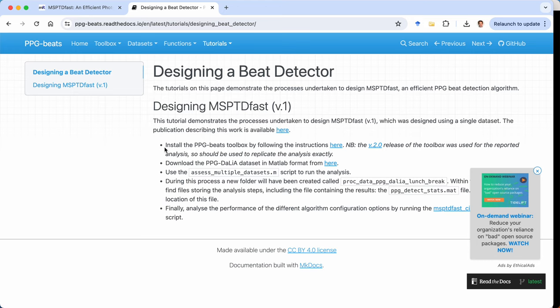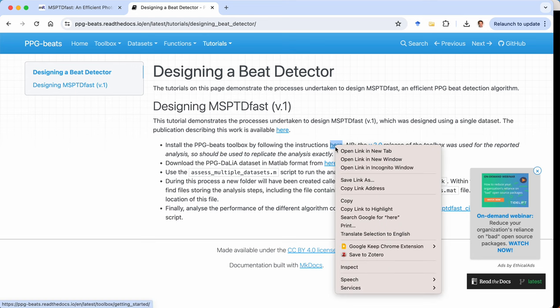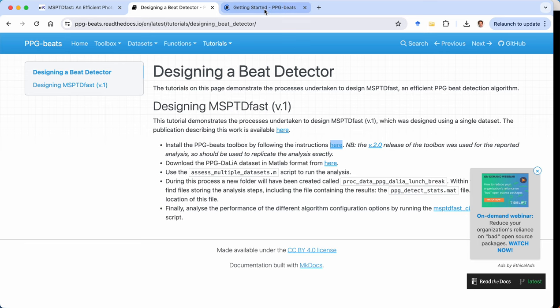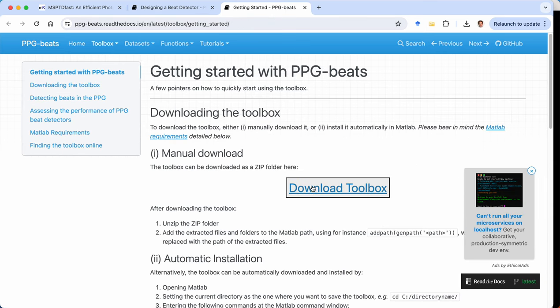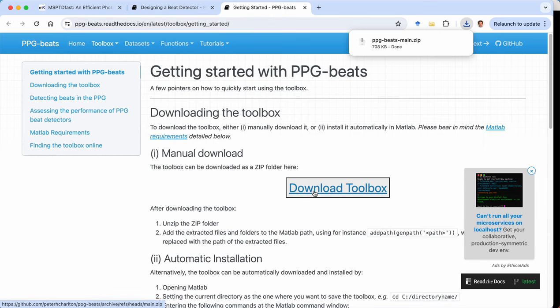So the five steps that we will follow in this tutorial are these five bullet points. Firstly we're going to install the PPG beats toolbox. So we'll download the toolbox as a zip file.